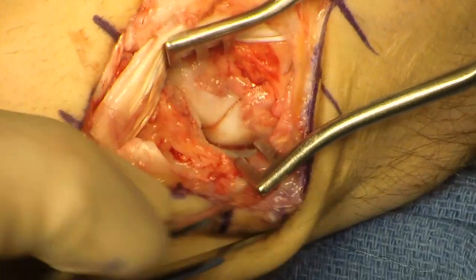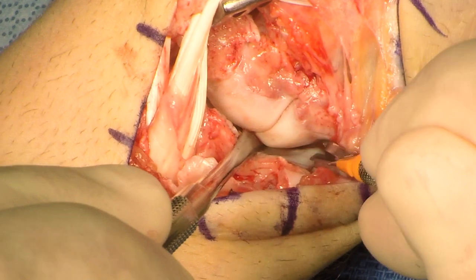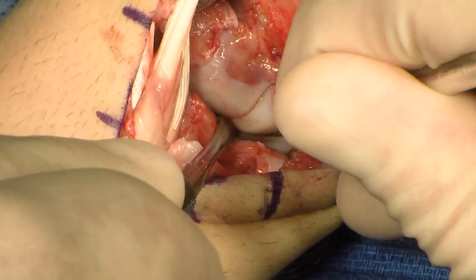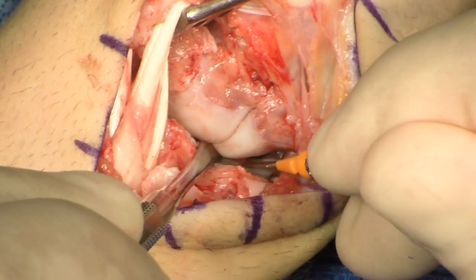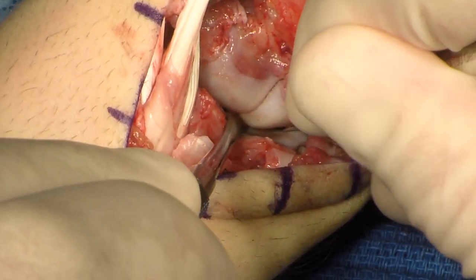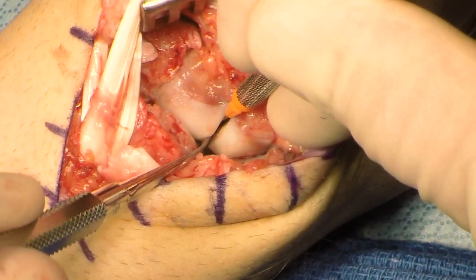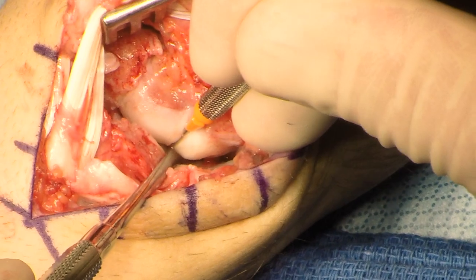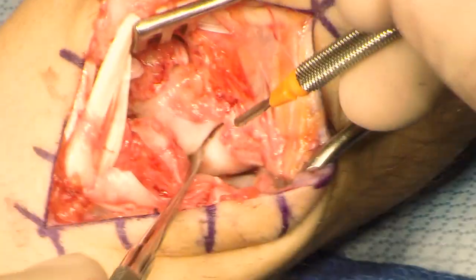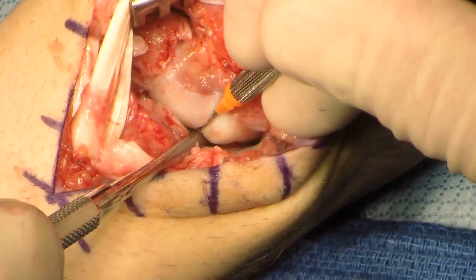The hamate is then exposed. A retractor is placed between the fourth and fifth dorsal extensor compartments. The capsule between the triquetrum and hamate is divided with a 67 beaver blade. Care is taken not to plunge with the blade, as the deep branch of the ulnar nerve is in the vicinity. A freer is then placed between the capitate and the hamate, and the beaver blade is used to divide the capsule, taking care not to injure the articular cartilage.